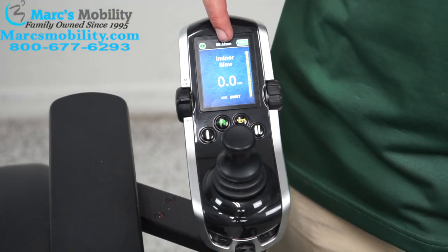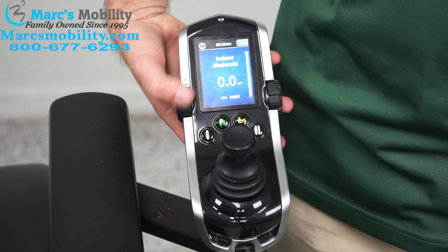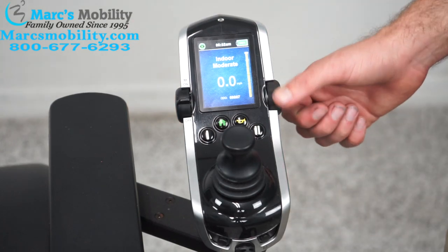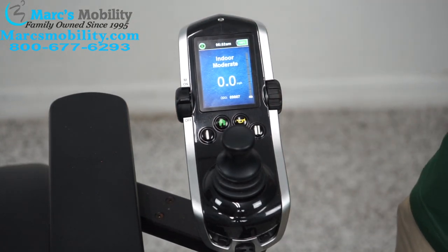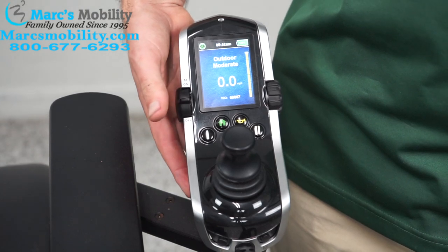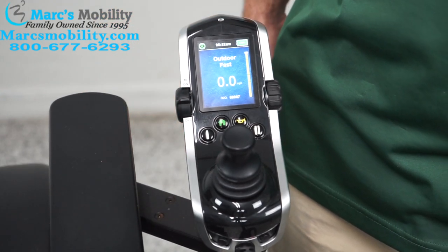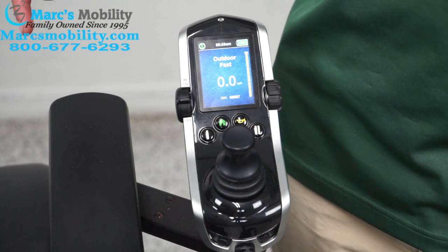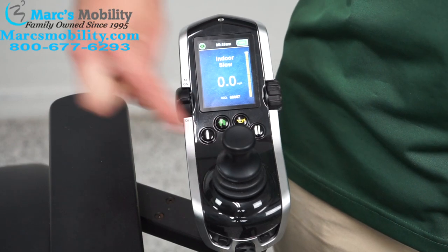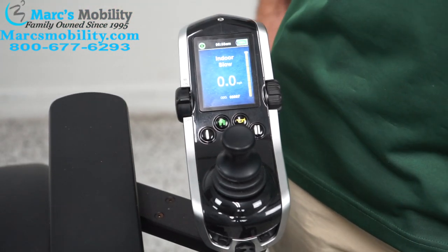If you want to cycle the profile, I am on indoor slow. To go to indoor moderate, take this little switch and go up one. Now I am at indoor moderate — the top speed is going to be around two and a half miles an hour, and again I can adjust that here. I can go through all four: indoor slow, indoor moderate, outdoor moderate, and outdoor fast, which is about six miles an hour. If you want to get back to indoor slow, press button one — this will always take you back to indoor slow no matter where you are in the settings menu.